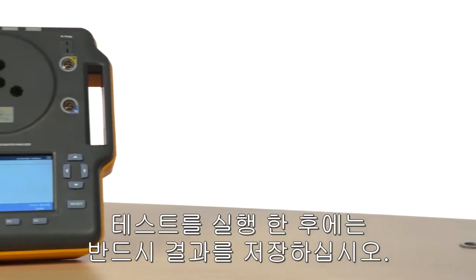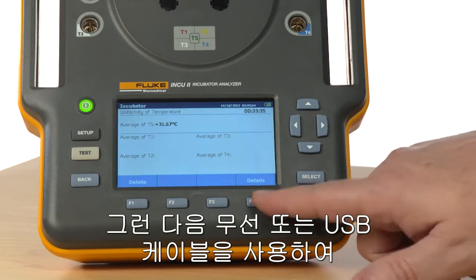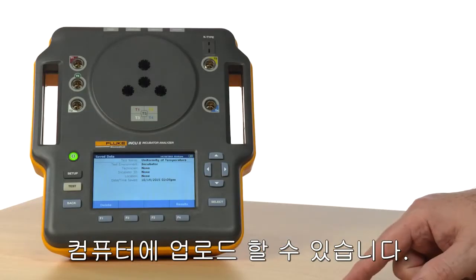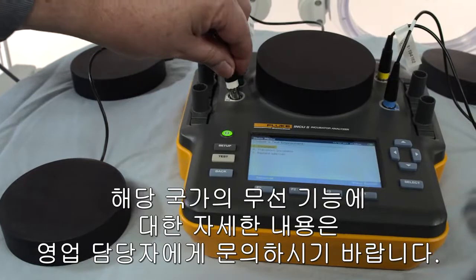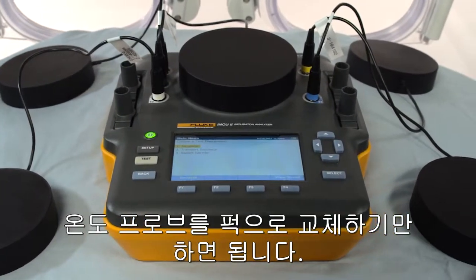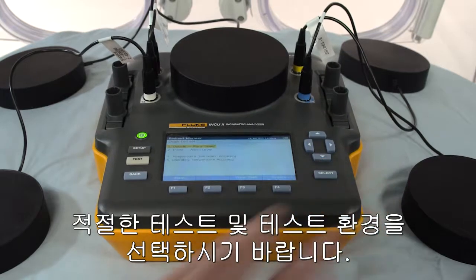After running a test, be sure to save the results. The results will be saved to the device and its onboard memory, and can then be uploaded to your computer wirelessly or by using a USB cable. Ask your sales representative for more information about wireless capability in your country. To test radiant warmers, simply replace the temperature probes with the radiant pucks, position them around the warmer according to the standard, and select the appropriate test and testing environment.